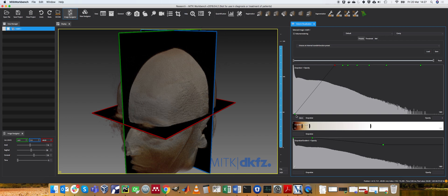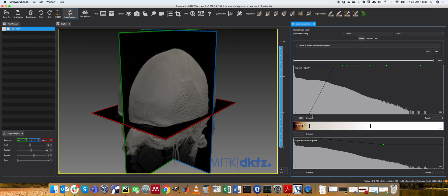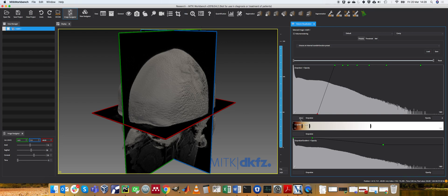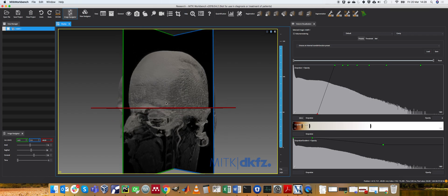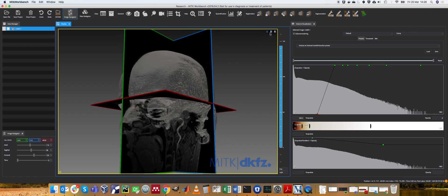So what we're saying now, values up to 320 are completely transparent. So this is where you can start to see through it.